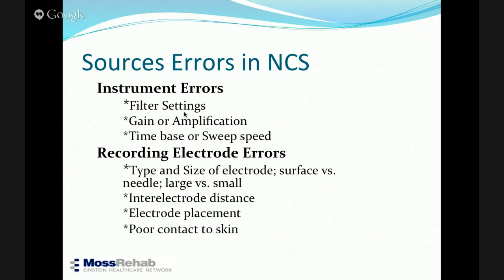What do you think, guys? I think it would be closer to the same. Closer to the, well, it is larger, I agree. Now, does that represent... usual? So you have somebody, when you do it with the surface, has a 2 millivolt response. When you do it with the needle, it has a 15 millivolt response. So do you think we are missing something there?